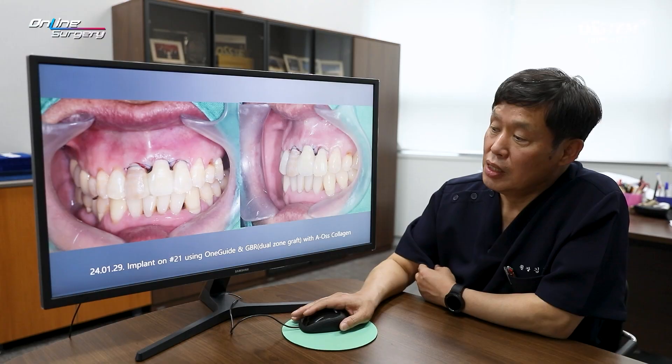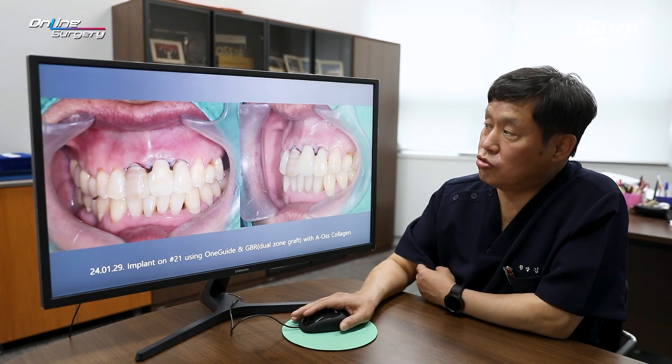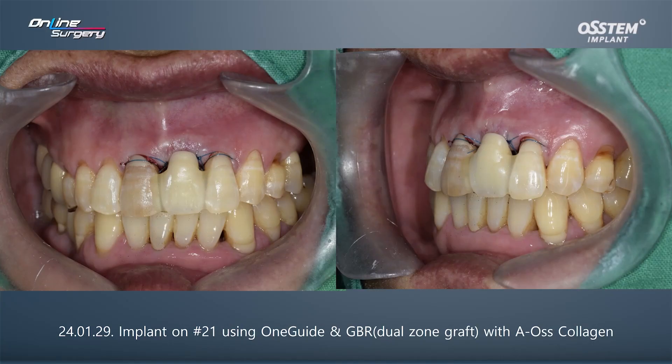This image shows the condition right after the surgery. Since this is an anterior tooth, it could be aesthetically unappealing. Therefore, we temporarily attached the tooth to the adjacent teeth using resin.